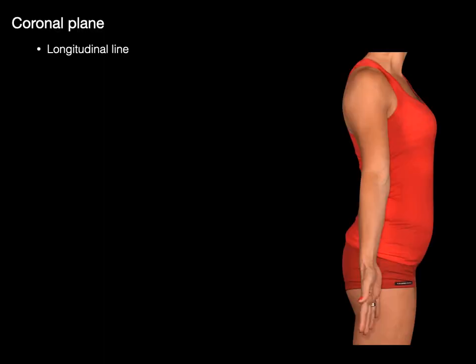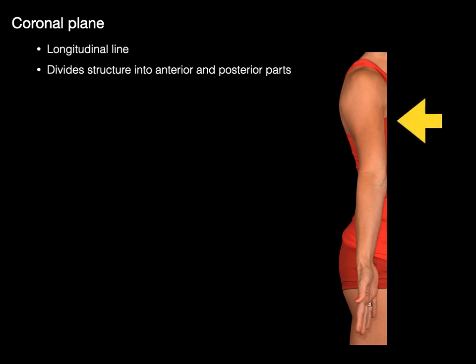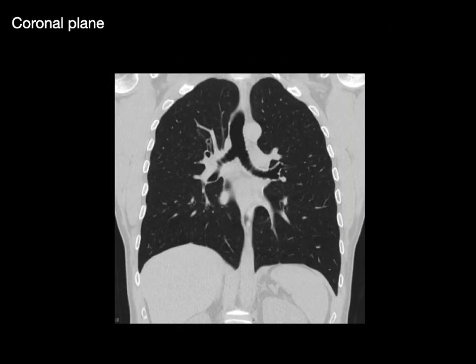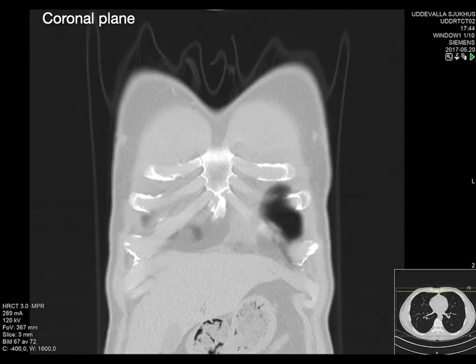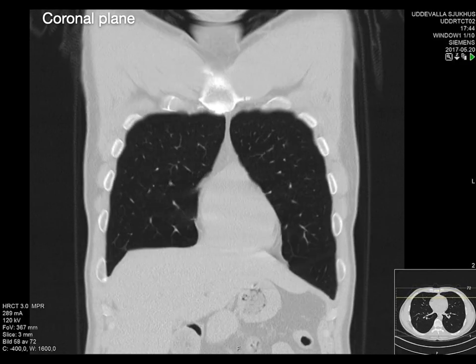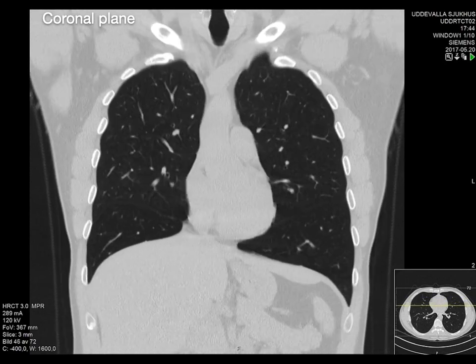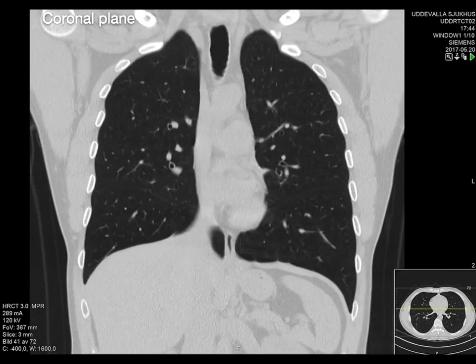A coronal plane is a longitudinal line that divides the structure into anterior and posterior parts. Here it is in a coronal plane as if you're nose-to-nose with the patient — superior, inferior, right, and left. As you move through this series of sections, you can see really cool anatomy going from front to back.